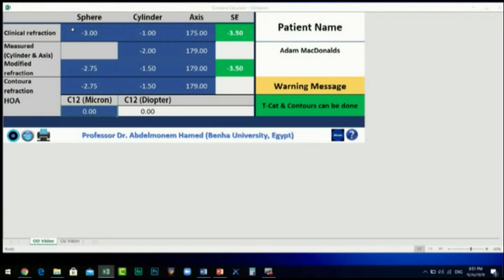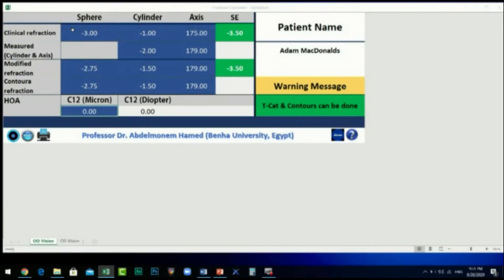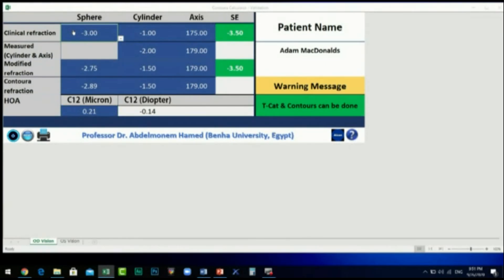In the fifth row, if the patient has a high order aberration of 0.21 microns, the Contour Calculator will convert it to diopters. The calculator will then add this value to the modified sphere in the fourth row, to be treated at the same time as the modified refraction.